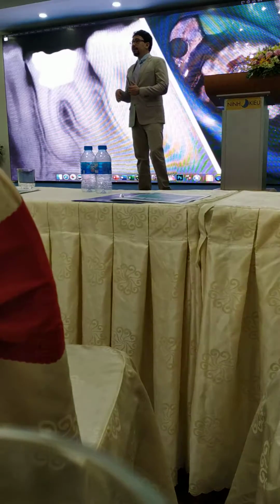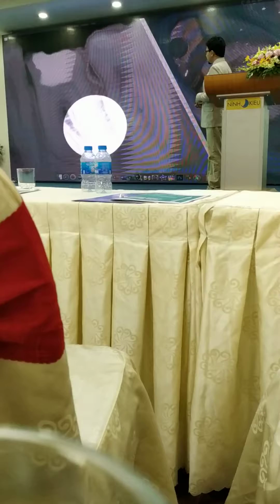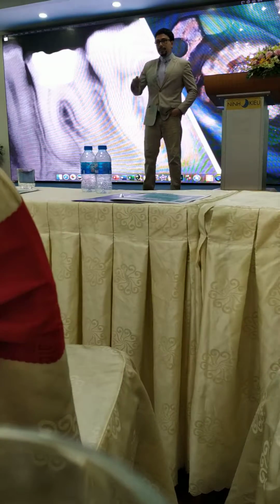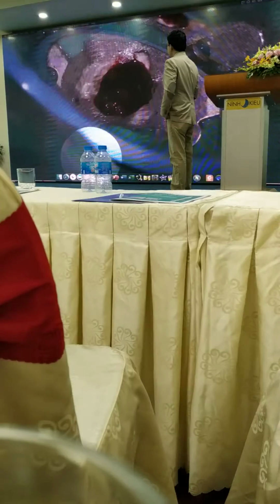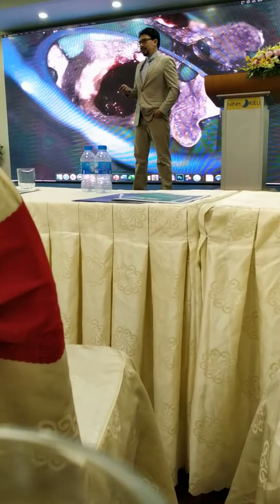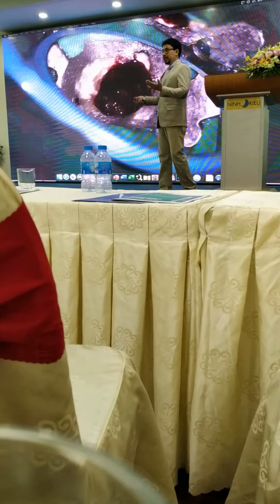So they told me, okay, if you are able to do the root canal treatment and to do something for stopping this resorption, we will proceed with the final restoration. So I took the patient to my office. I removed the old restoration. There was a lot of bleeding. It was kind of strange because that molar was necrotic already, but as soon as I removed everything from the pulp chamber, it started bleeding a lot.